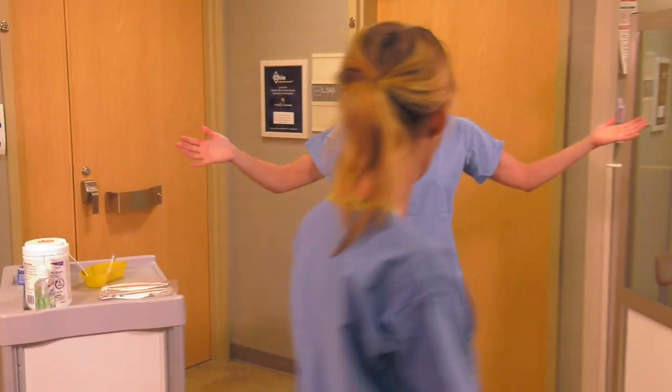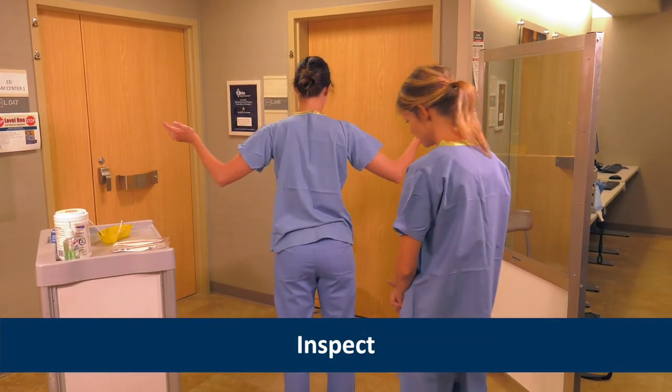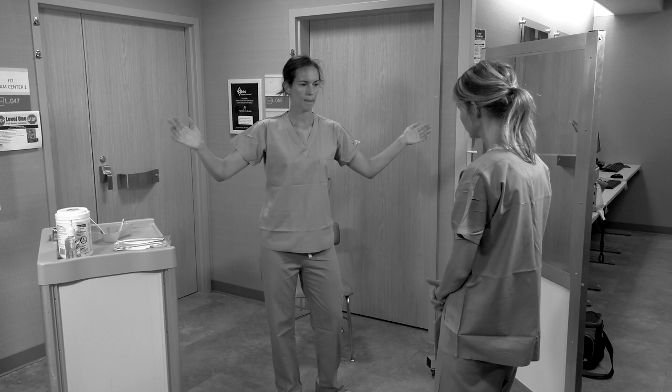Once all the Level 1 PPE is removed, Angie helps Heather inspect her clothing for contamination. If contamination is identified, Heather would need to shower immediately and inform the Occupational Health Coordinator about the potential exposure.